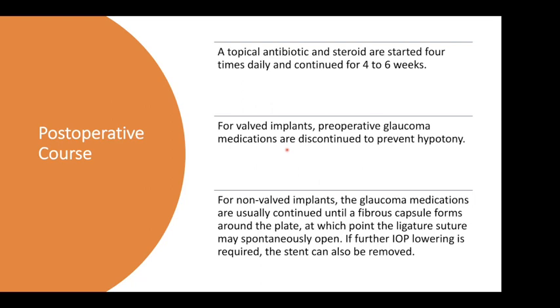Anyway, for the non-valved implants, if you decide to put Molteno or Baerveldt implants, just put the patient on all the anti-glaucoma medications, because usually the implant doesn't work in the early post-op until the suture is removed or it dissolves around the tube.